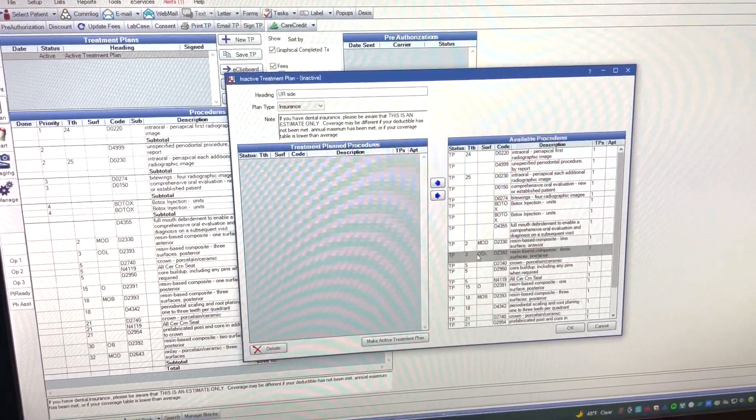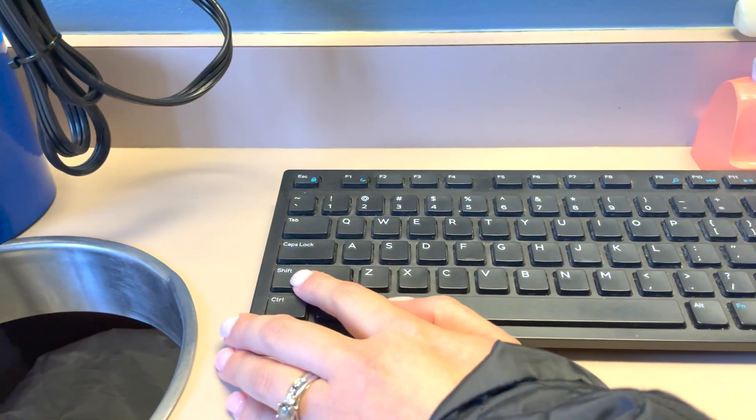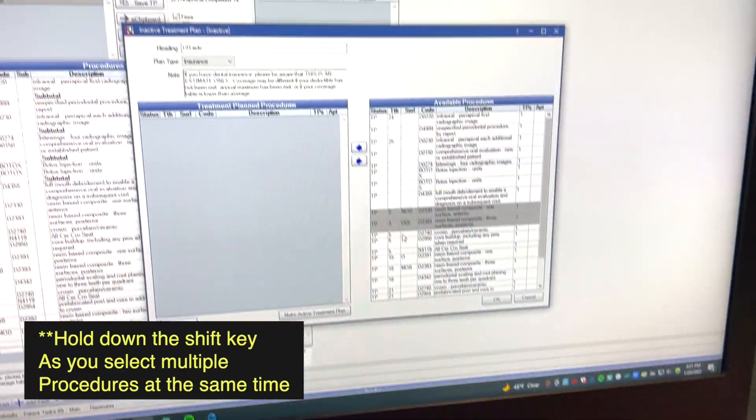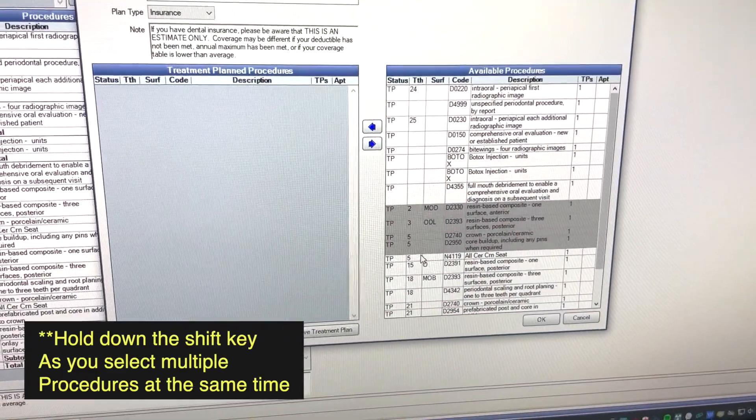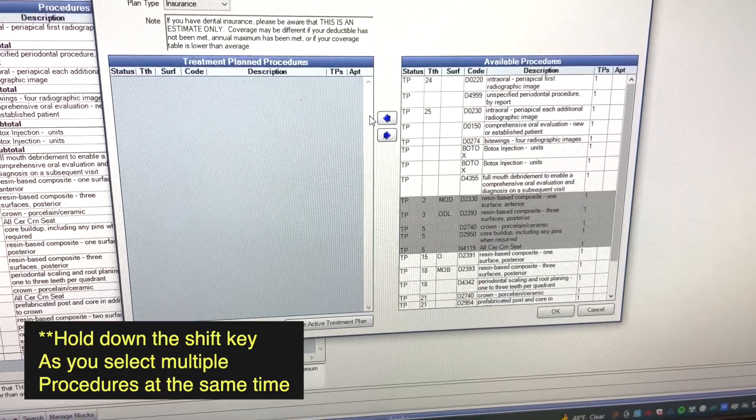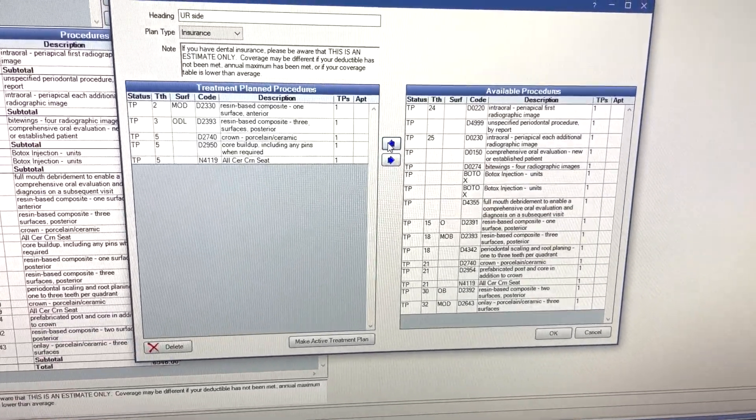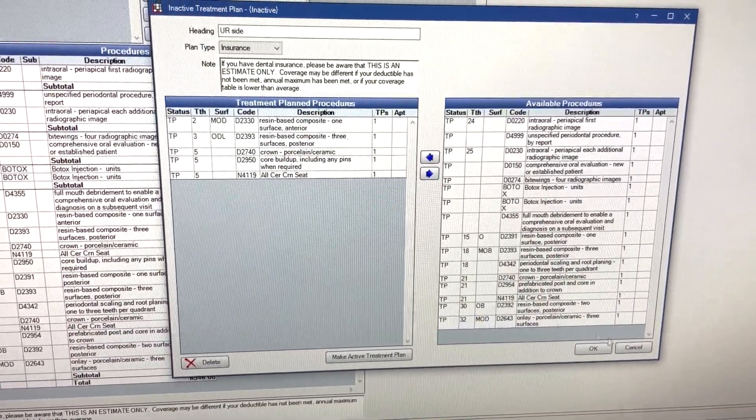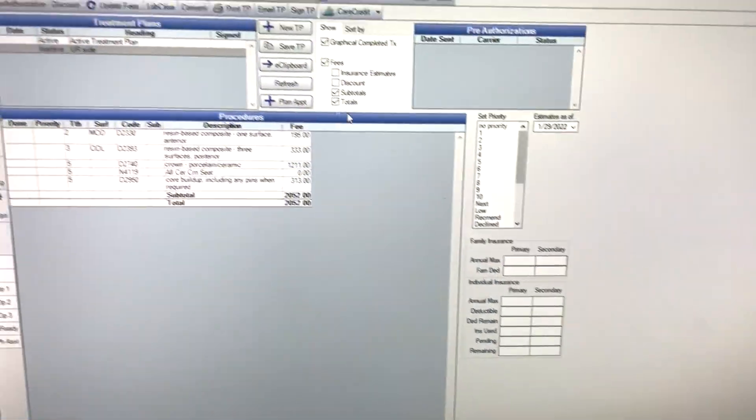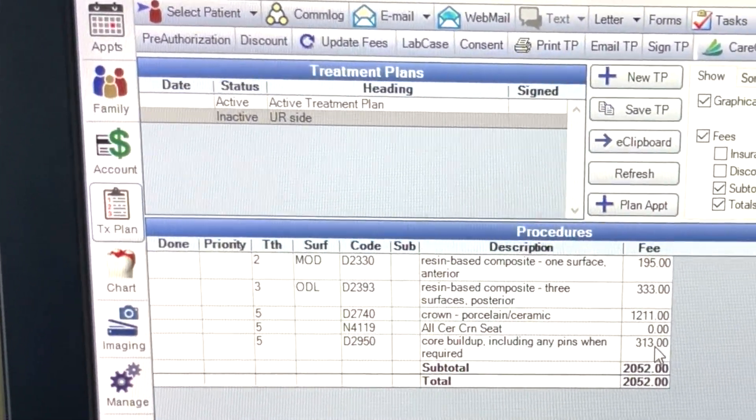Now we come here, this is all that we charted. We're going to select everything that we're going to do. So you're going to click shift. We're doing tooth three and we're also doing something on five. Okay, and then we click this little arrow and it's transferring it over. We click okay, upper right side. There you have it.